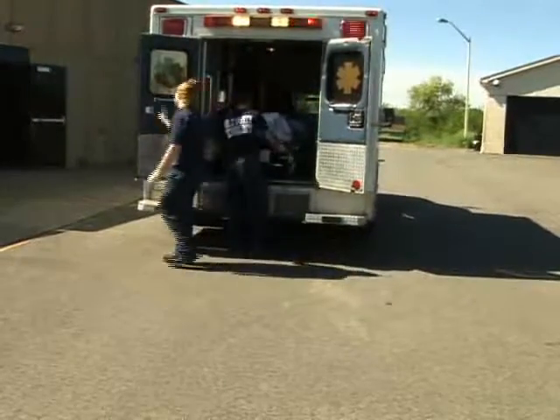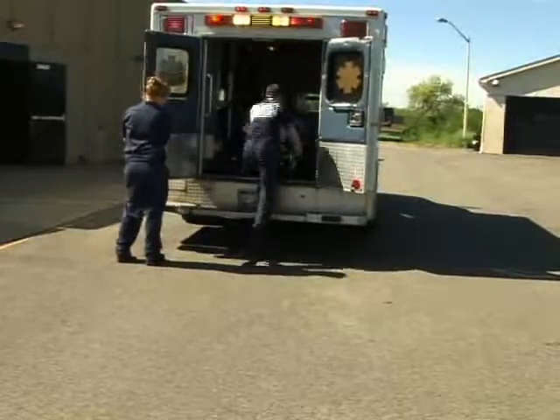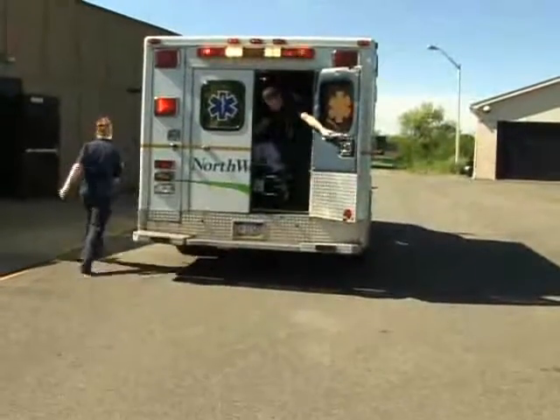Remember to move the patient's feet first. However, when you encounter inclines and stairs, keep the patient's head up and feet down.